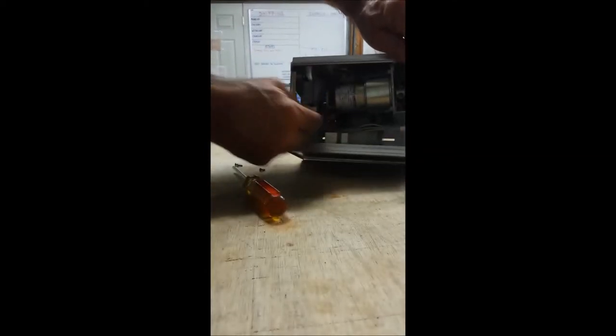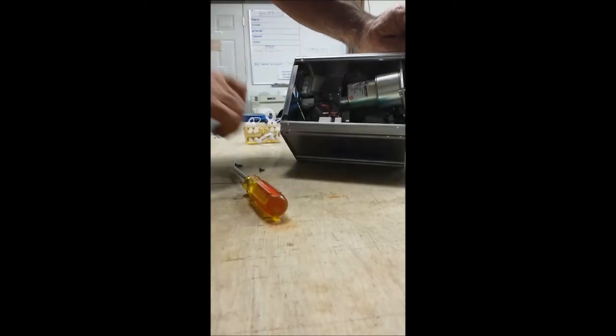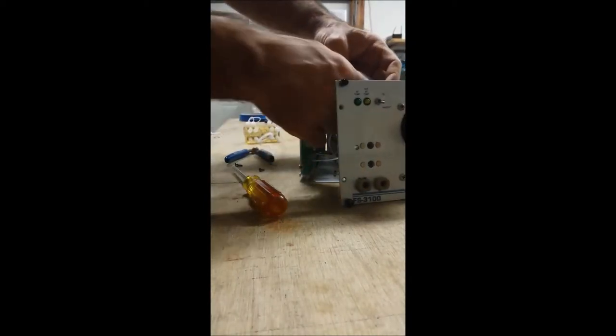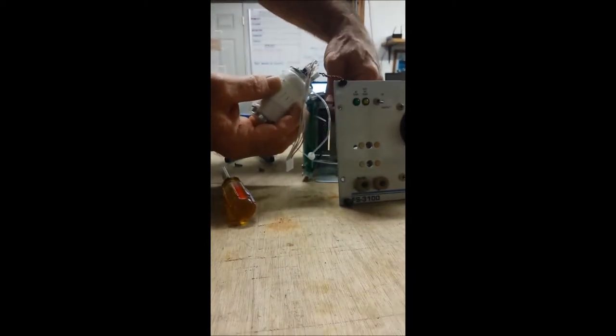And you see now that this starts to come apart, you're going to want to pull this right here. And then you're going to unscrew these fittings that are connecting there. And then, if it has the securing strap, you're going to cut that. And at this point, the heater will have one more cable connection, which will connect to here.